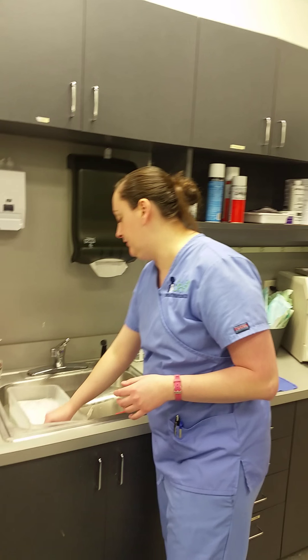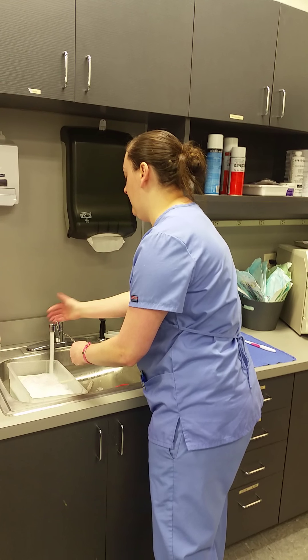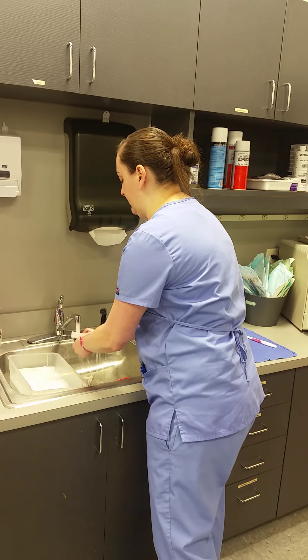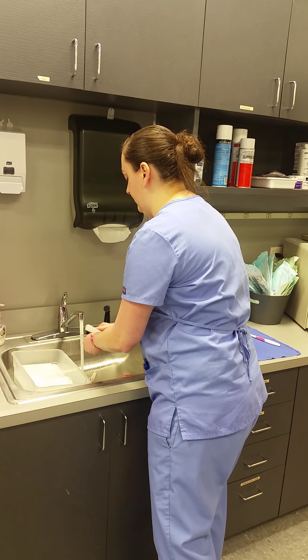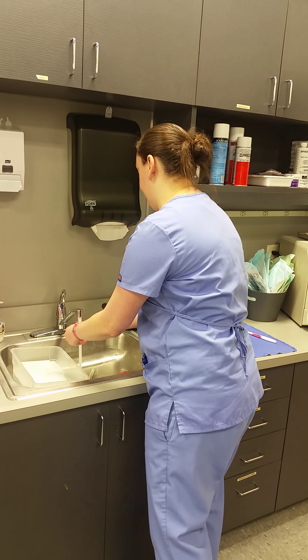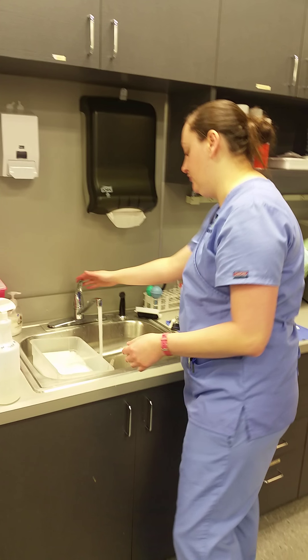Once it's done soaking, you'll take it out, rinse it off, and then you'll usually scrub it to make sure there aren't any blood clots or anything like that left on it. Then let it sit out and dry.